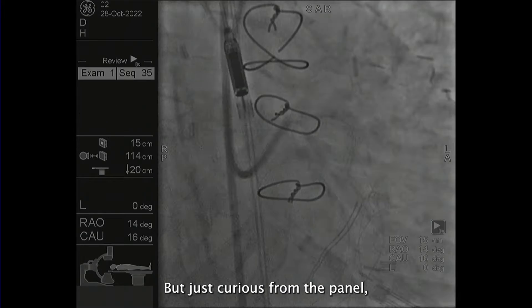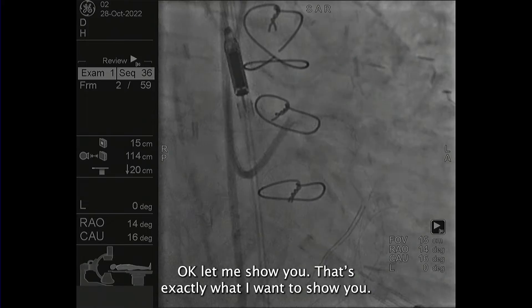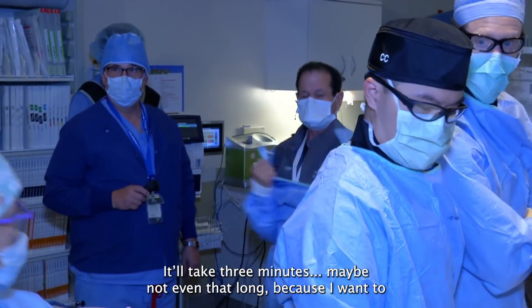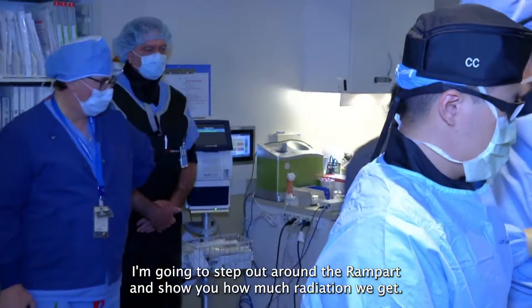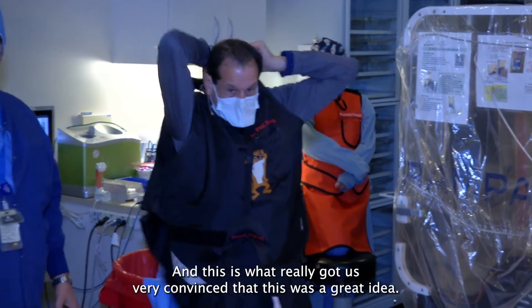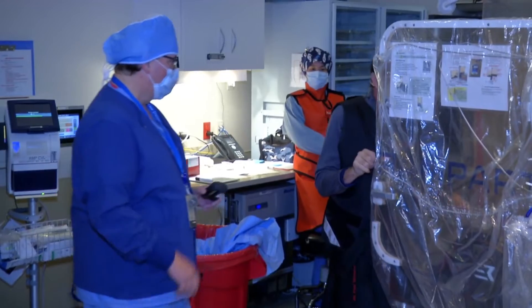Just curious from the panel — how are you guys monitoring your radiation real-time? That's exactly what I want to show you. I'm going to get my lead and do this — it'll take three minutes, maybe not even that long. I'm going to step out around the rampart and show you how much radiation we get here. Steve Studerman is our radiation safety officer, and this is what really got us very convinced that this was a great idea.